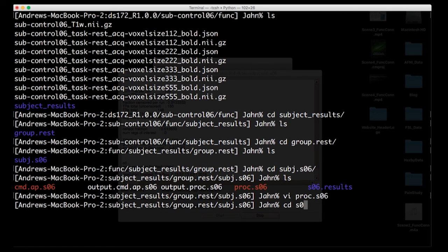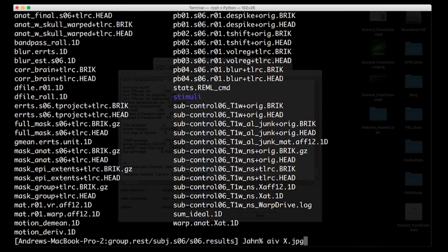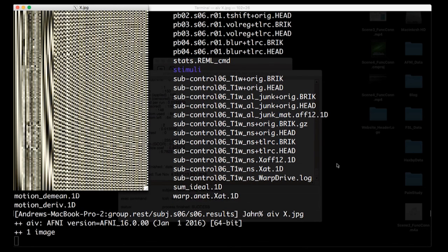So let's take a brief look at that in our SO6.results directory. Now there's this design_matrix.x.jpg, which I'm looking at with the aiv tool. And this may look completely incomprehensible to you if it's your first time looking at something like this. But notice these first, I think four or five, that those are the polynomials for things like a linear drift, quadratic drift, cubic drift, and the longer your time series is, the higher order polynomials it's going to model out. These next six are your motion regressors and other six are your motion derivatives.